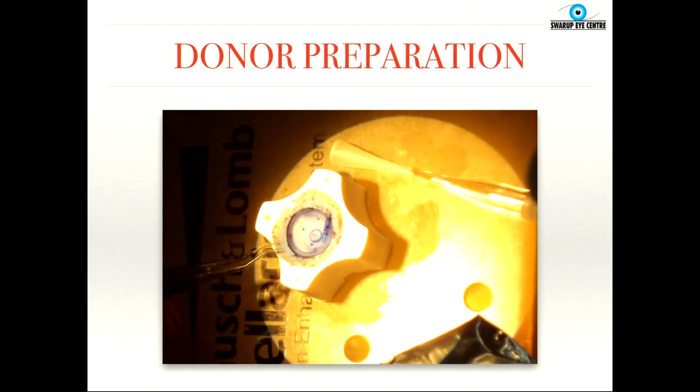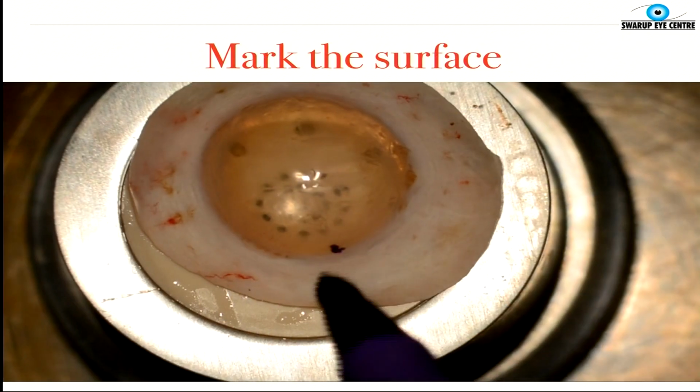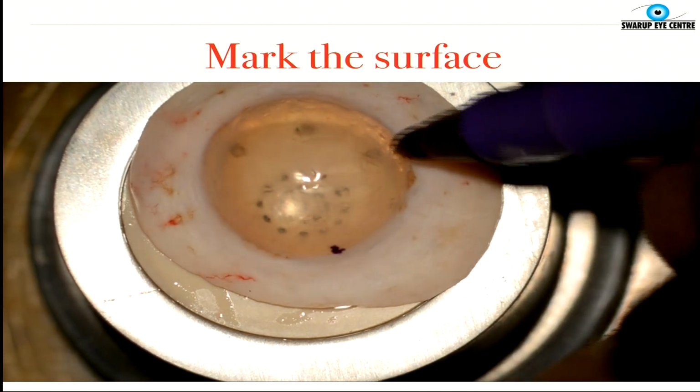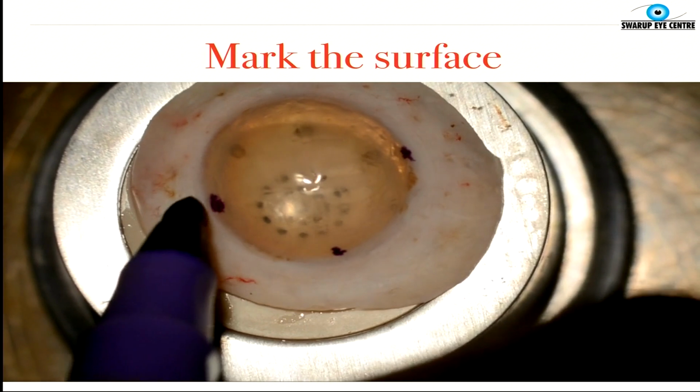So I'll just run through the surgeries. The donor preparation, this is partly covering my second talk as well. So basically you need some sort of a Teflon block on which you can keep the corneoscleral rim. Initially, it's a good idea to mark the limbus so that when you invert the graft, you know the borders of the limbus.